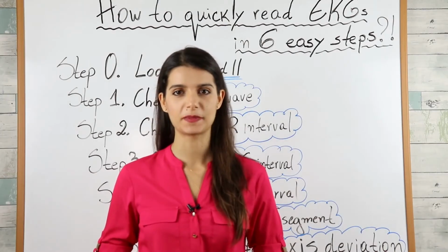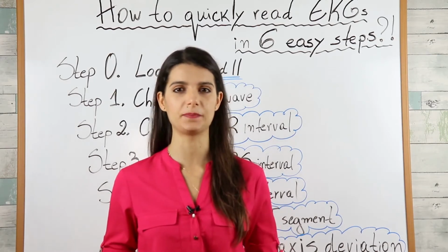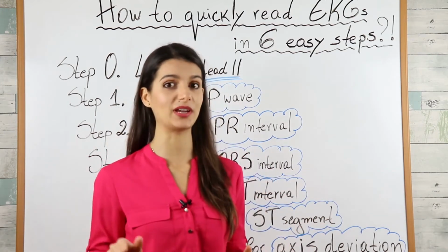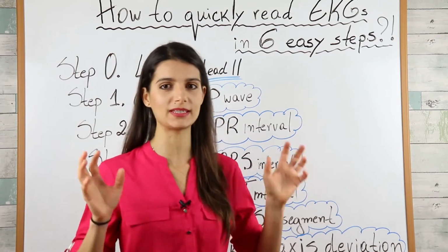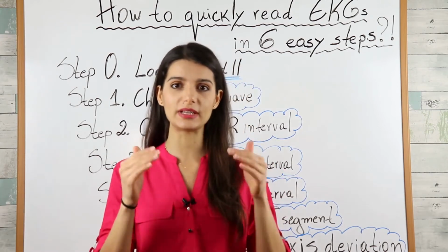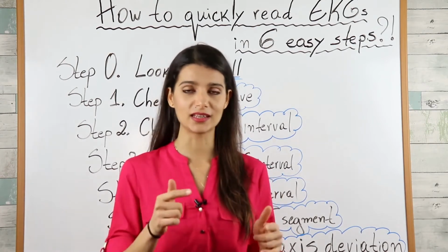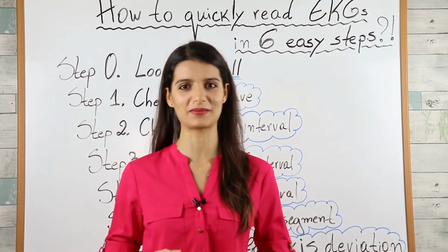EKGs can be challenging, especially when you don't have a systematic approach to read them quickly and easily. Try to follow these steps while doing questions at home. Just make sure you don't skip any steps so no detail gets overlooked. The goal here is to get so used to using these steps and this method that on exam day, when pressured by time and emotions, reading the EKG should happen almost automatically. And it's pretty easy. By the end of this video, the EKG questions might even become your favorite ones.